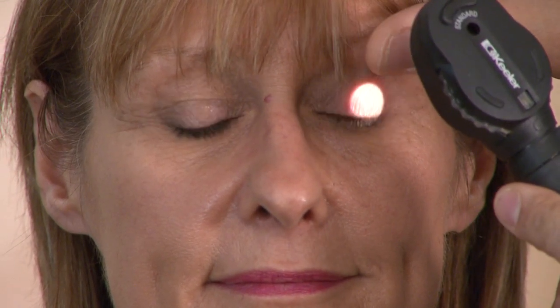Or if the redness is in the corner or the bottom of the eyelid or eyeball, we call it peripheral. Ask the patient to look down as well. There are a few blood vessels there but they are peripheral, not near the cornea, so probably Julie has a bit of dry eyes. Then you look at the corneal reflection — a circle reflecting back — and you can see a beautiful circle on the cornea, not hazy, meaning the cornea has no problems. You also look at the pupil, check the pupillary reaction by moving the light in and out — the pupil reacts well, normal size, and it is circular in shape.